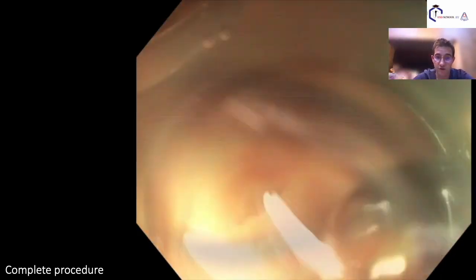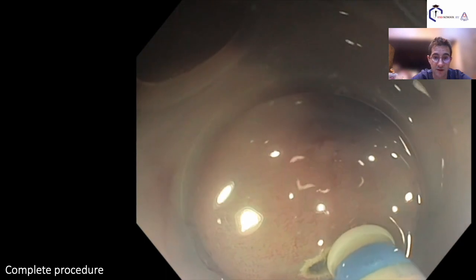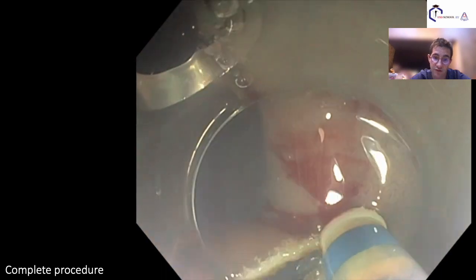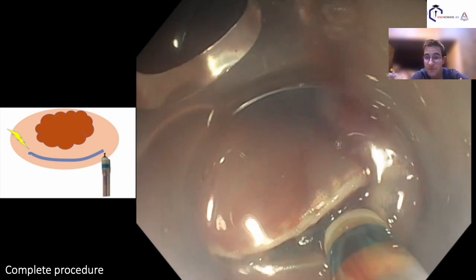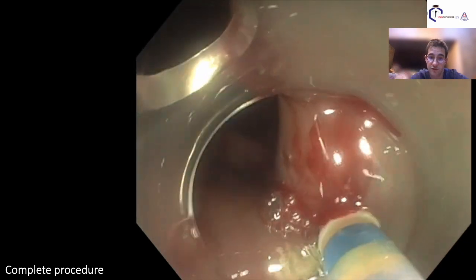So here it was difficult to go from the right to the left, so I chose to change sides to the opposite edge, and then it was easier to go there and to join. But once again there is a valley, so we will inject, because if we don't inject, the depth of the incision will be less on the valley than in the other part of the hill.